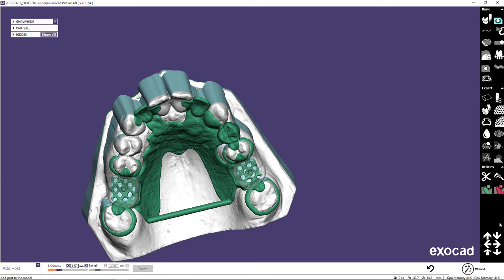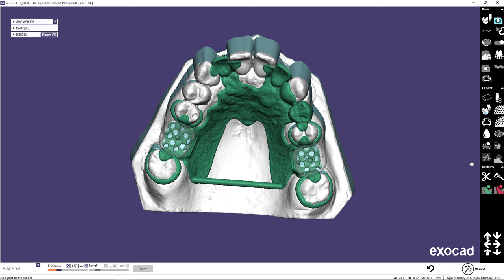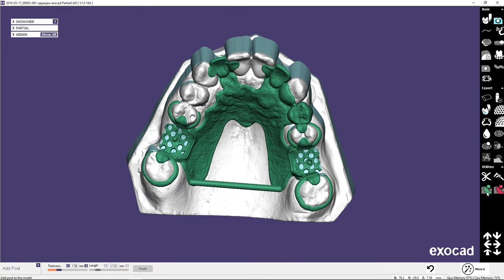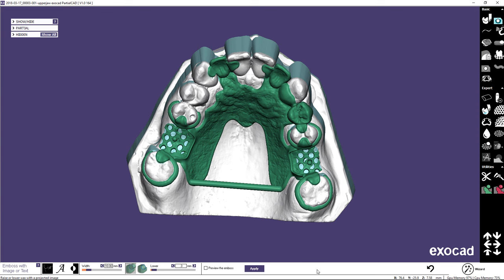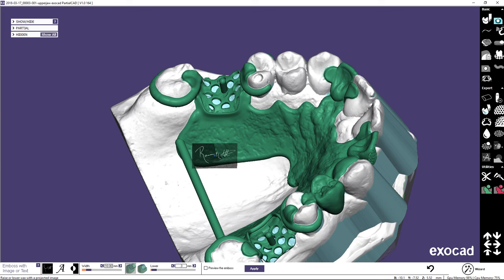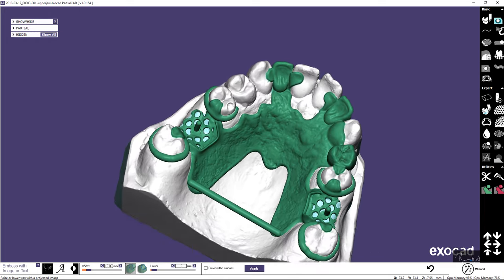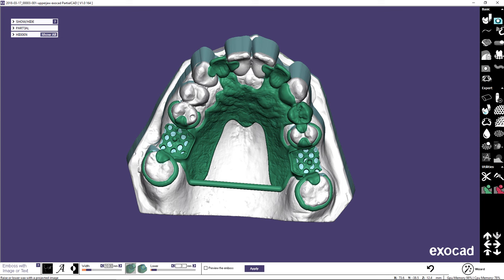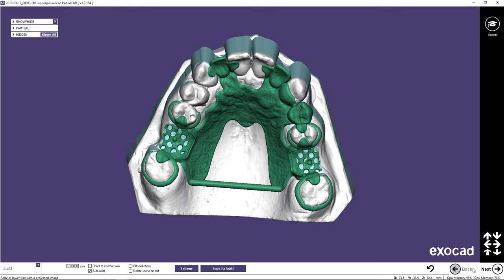Texts or images can be embossed by choosing the embossing option. Patient names, case numbers, and logos can be added. Embossing material can be added or subtracted. Leave expert mode by clicking on Wizard and proceed to the last step.